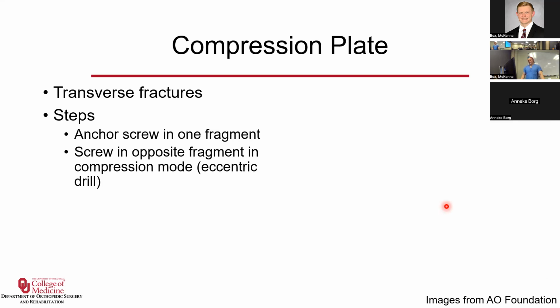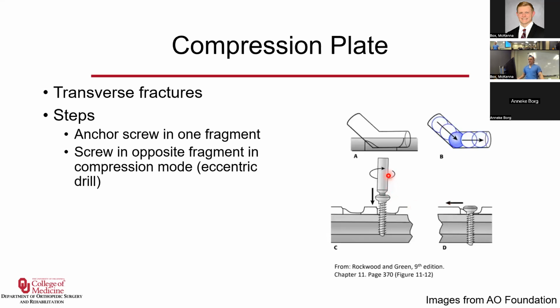So going to compression plating. Compression plating is a really big concept. As I mentioned, it allows you to get that primary bone healing. But it's really hard, or at least it was for me, because I'm stupid. It's hard to understand at first.